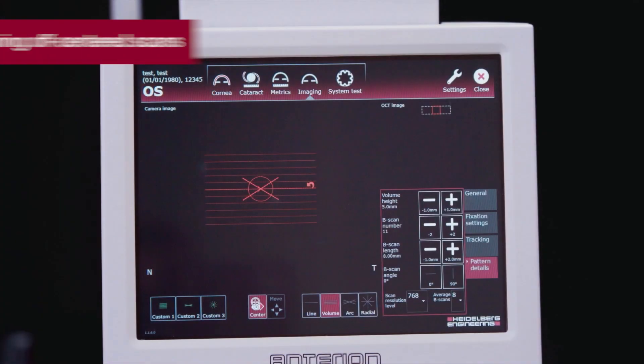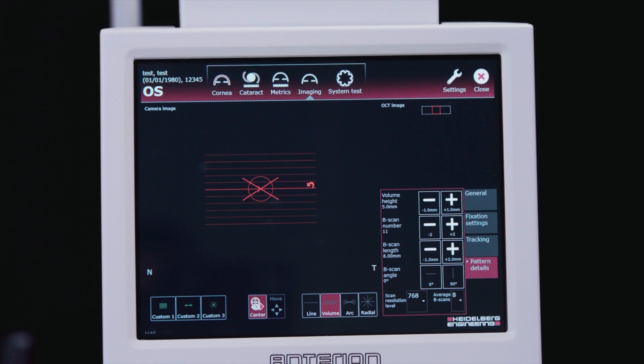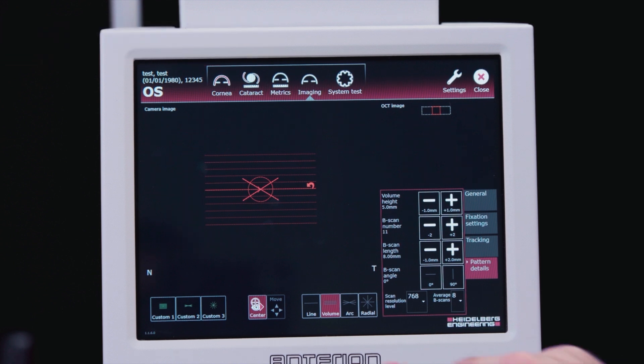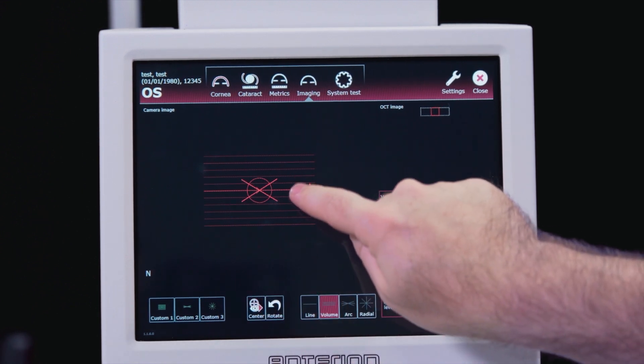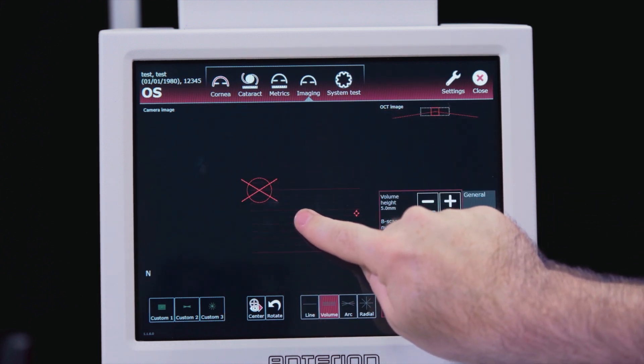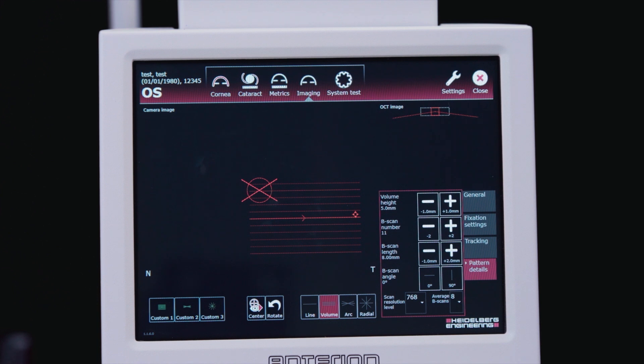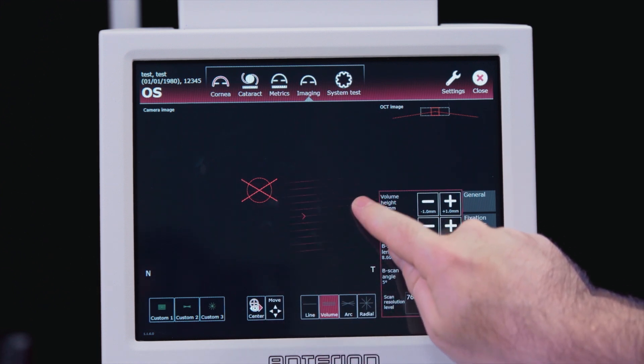By default, the scans are centered on the eye's corneal vertex. To reposition for an off-centered scan, press the center button to deactivate the center tracking. We can then acquire images at an off-center position. You can also rotate or move the pattern with the rotate button.